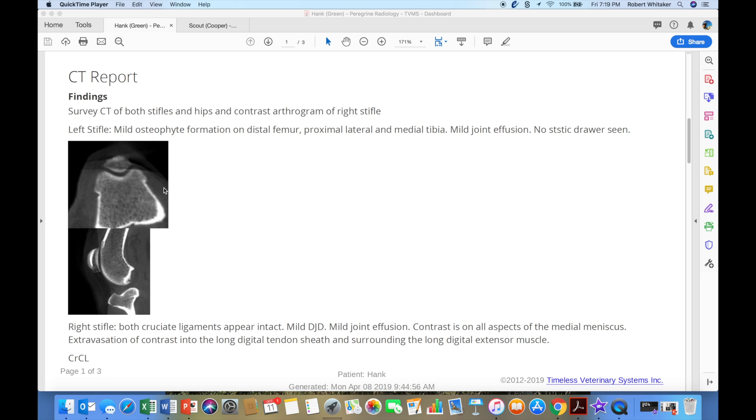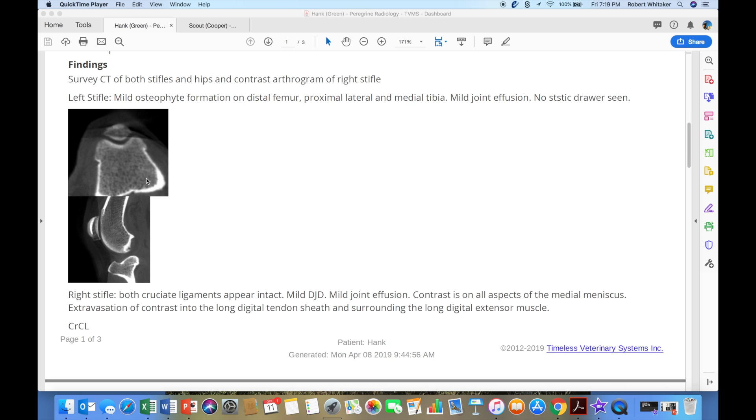Our report is heavily dependent on how well we provide history and also how well the images are that we scanned. In Hank's case, we did overload the joint just a little bit with too much contrast — so there's some contrast in the image that isn't supposed to be there. But the radiologist worked through it and was able to see some things, though he does a little bit of hedging at the end of the report. The good thing about Peregrine is they're always going to give you small images that indicate what they see, so it's a learning experience as well as a medical report.